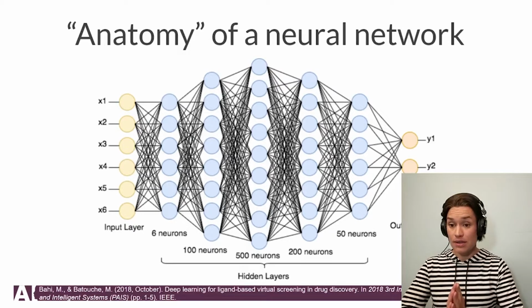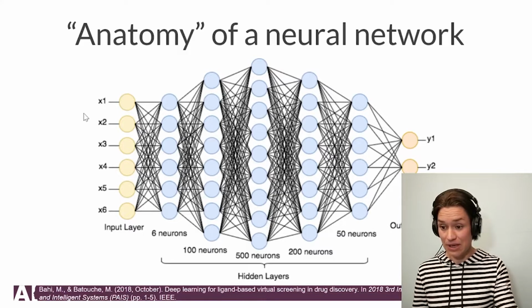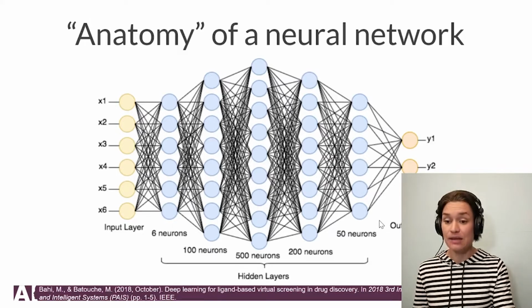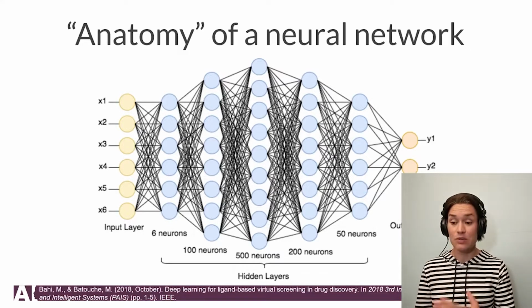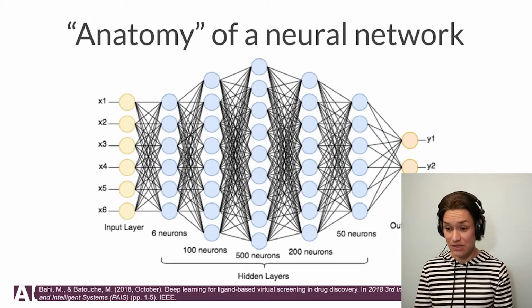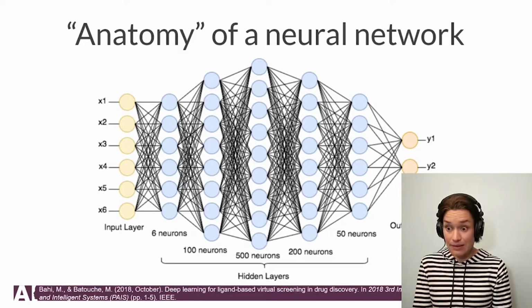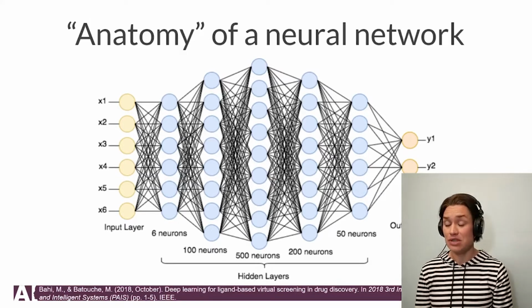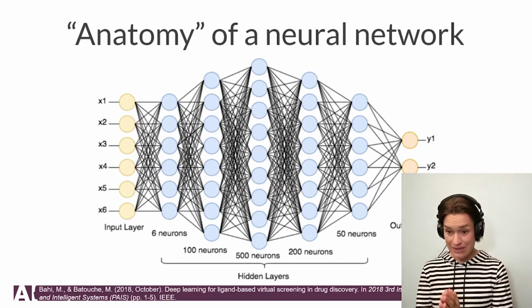It is called deep neural networks because it has many layers. Between the input layer and the output layer, we have so-called hidden layers. And they're called hidden because we don't see what's going on there. That was also one of the concerns somebody wrote in the chat, that, oh, we have this black box. We don't know what's happening there. And that's true. There are mathematical operations happening that we can later try to derive what happened, but we don't see it. It's not being shown to us while it's happening.